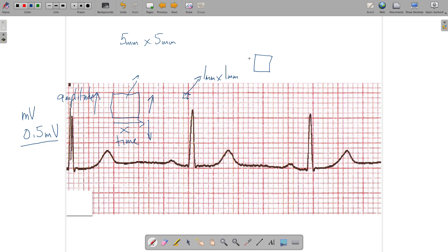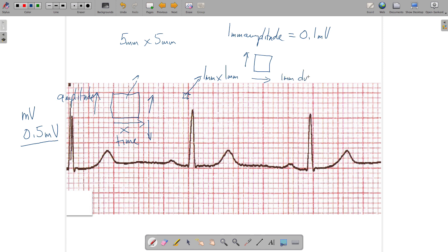Each small box represents both an amplitude and a duration. Each small box is 1 millimeter by 1 millimeter. So 1 millimeter of amplitude equals 0.1 millivolts of deflection. And 1 millimeter of duration — meaning a millimeter from the left to the right of the paper — equals a time interval of 40 milliseconds. Each millimeter of movement across the paper represents 40 milliseconds of time.